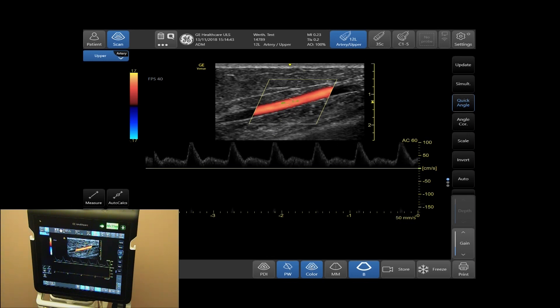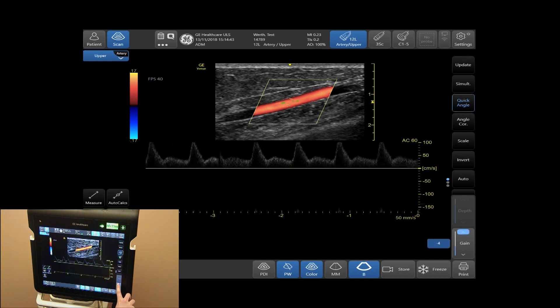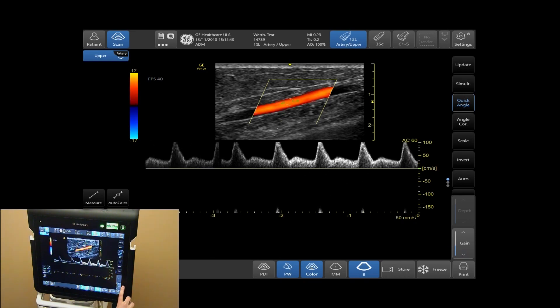To adjust your Doppler gain, use your gain arrows to brighten up or darken your Doppler signal.